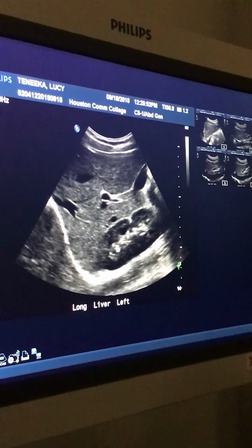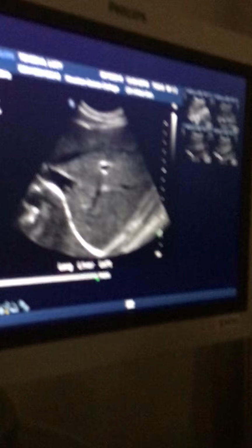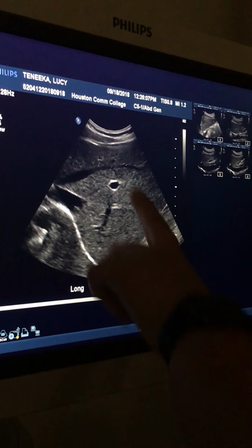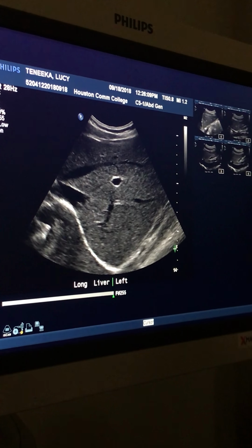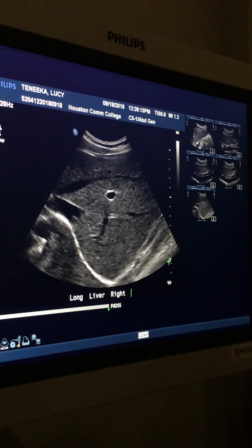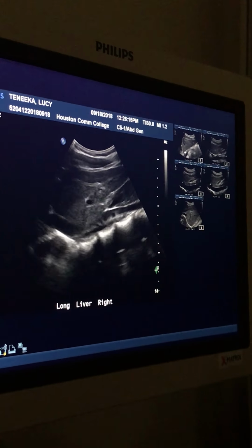So what I do, take a deep breath and hold it. If you just watch my hand, I'm just going to twist this way, and then I got rid of all that. So what did I just do? I stopped looking at it. So if you don't want the gallbladder and kidney in your picture, don't look at it. Just twist away so you're not looking at it, right? And you have a nice, beautiful right portal vein. You're welcome.